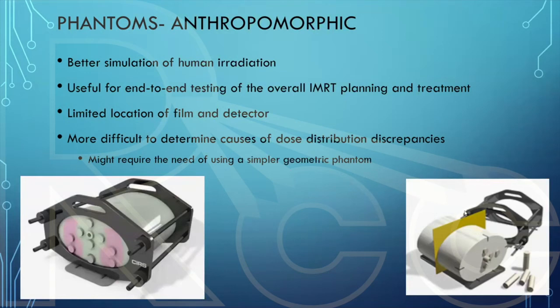In my experience, we usually start with the ideal. Everything is homogeneous. You are testing your commissioning machine under the best representation, and then you are adding more parameters or more variables. So it's easier for you to spot where you might have any issue.